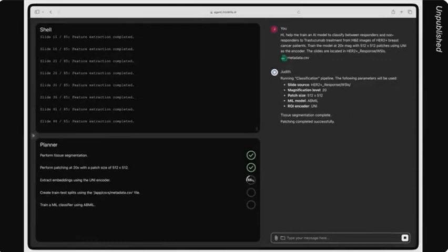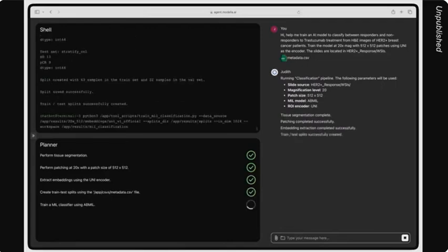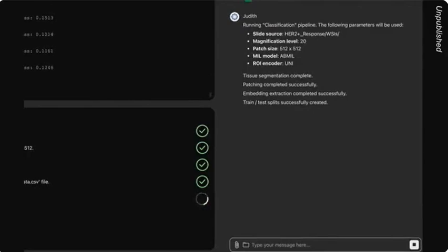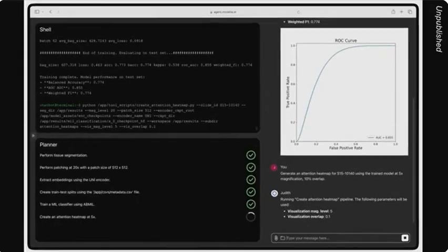But then it can make use of existing code and patch it together with some additional code that might need to be written. So in this case, it uses PathChat for morphologic description. It uses GPT-4o for writing the additional code that might be needed, and a host of different libraries that are out there to essentially conduct all of these independent tasks.